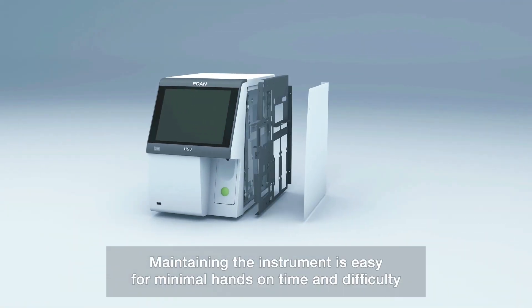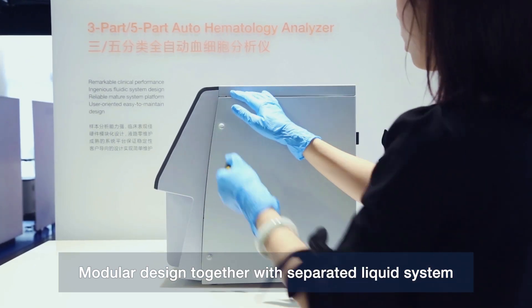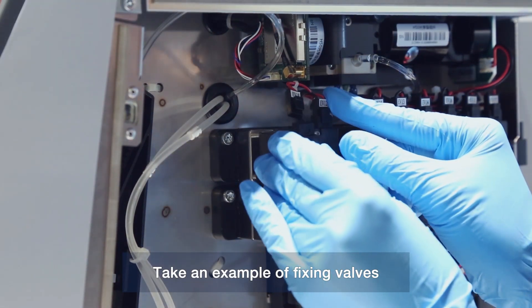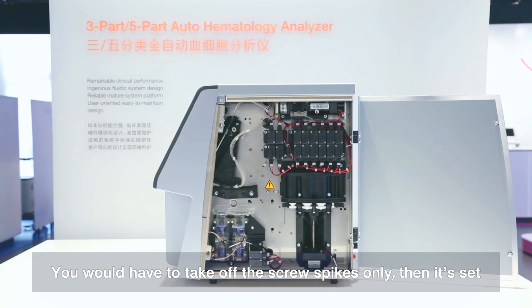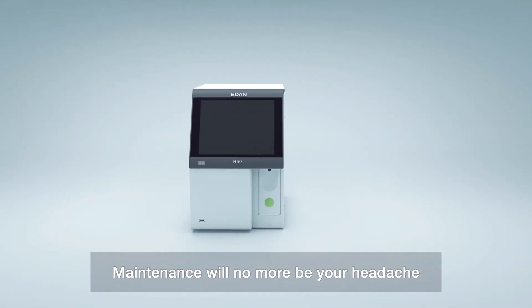Maintaining the instrument is easy with minimal hands-on time and difficulty. Modular design together with a separated liquid system means you may access any component and fix it without burden. For example, fixing valves requires you to remove only the screw caps, then it's done. Servicing our instrument is simple — maintenance will no longer be a headache.